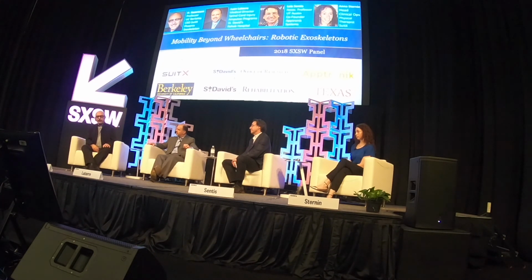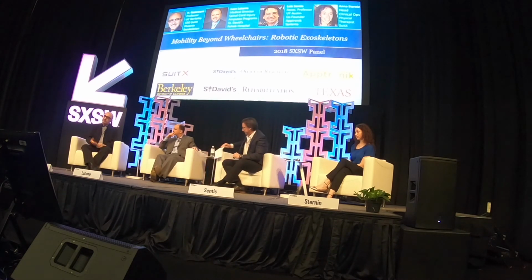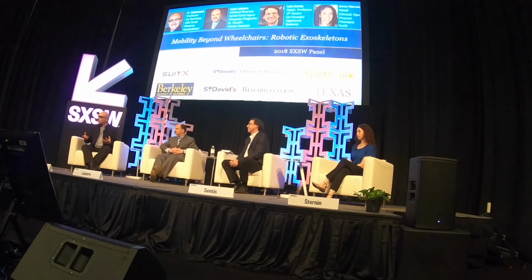So many of those will come, as you mentioned, and I'm not in any position to say which one is good, because it really depends on the physician's choice and how they use it. But let me give you an example. For a person who wants to be upright and mobile, we found out you just have to stand up, number 1, walk, number 2, stop, number 3, and sit, number 4. So like 4 commands you have to tell the machine. Of course, there are many more, but these are the minimum. So is there any way we can convey these 4 concepts to the machine in a robust form that becomes a product? Very simple, low cost. So more intelligence on the machine to figure out these 4 things, so the machine faithfully does them.